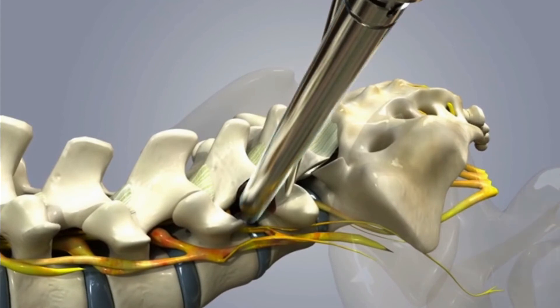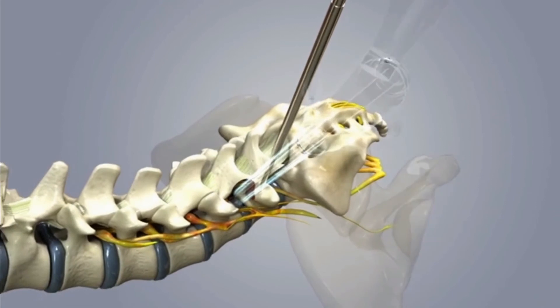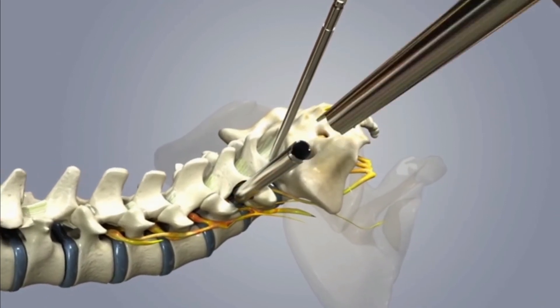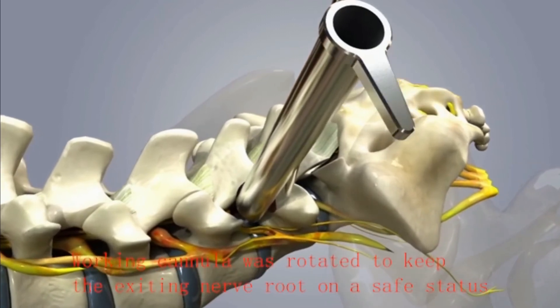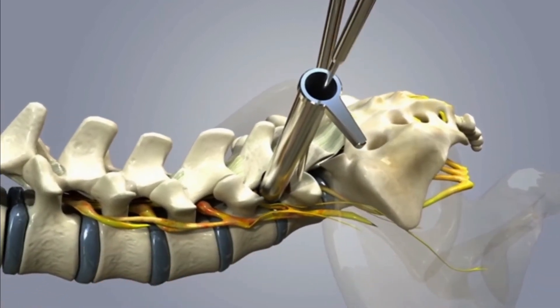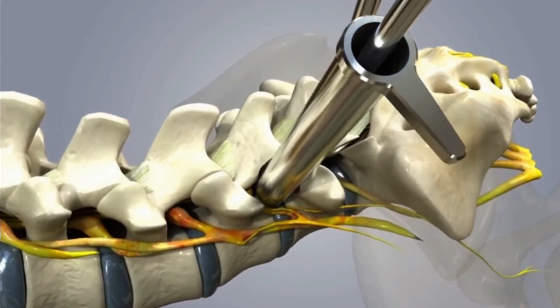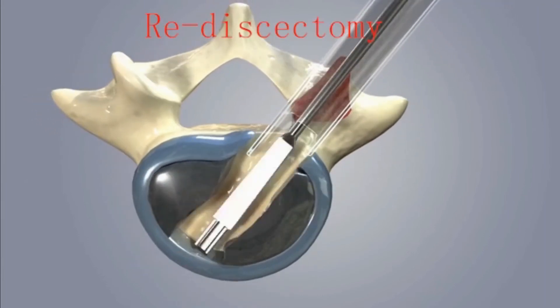The endoscope was removed and dissection was conducted through an implantation tube with an inner diameter of 11.5 mm. The implantation tube was placed into the intervertebral space with a fork-shaped tip, and these two edges could keep the traversing and exiting nerve roots protected out of the working channel simultaneously while performing a complete end plate preparation.